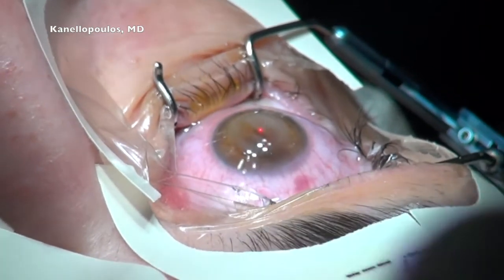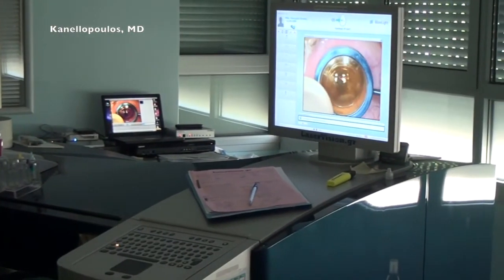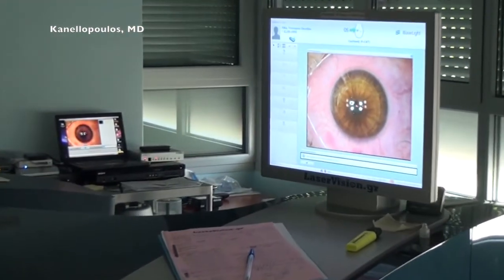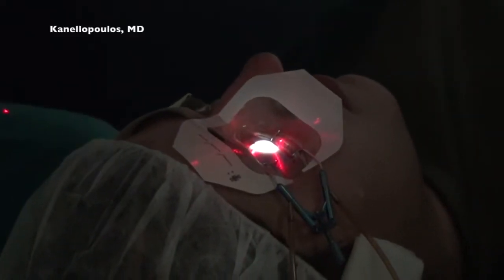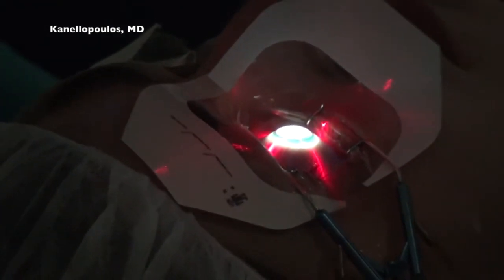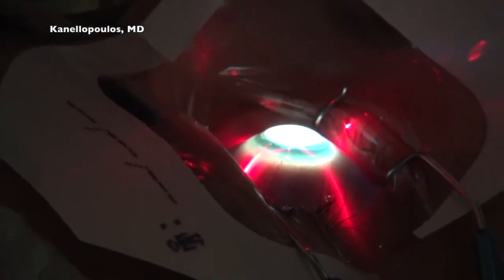I'm using suspension steroid in order to delineate the flap margins, and a Johnston applanator to iron out the potential micro kinks that the flap may have in the area under the flap that has been ablated. And here we're using the Avedro KXL1 device to boost the corneal biomechanics by using 60 seconds of 30 milliwatts per centimeter square fluence. This, of course, is not available in the US. This is available outside the US since 2013. And we're seeing how this device adds just 2 minutes to the procedure.